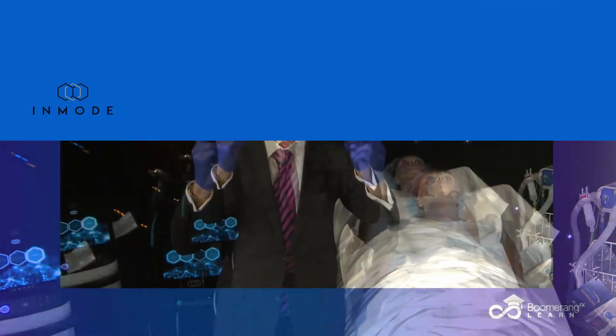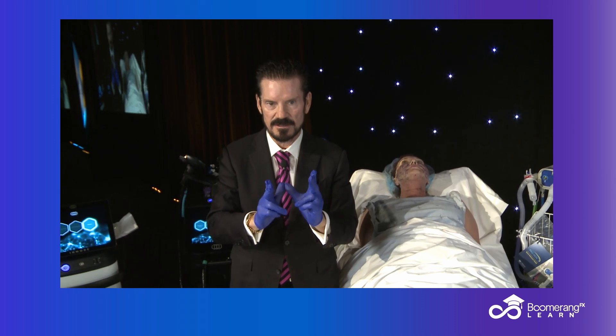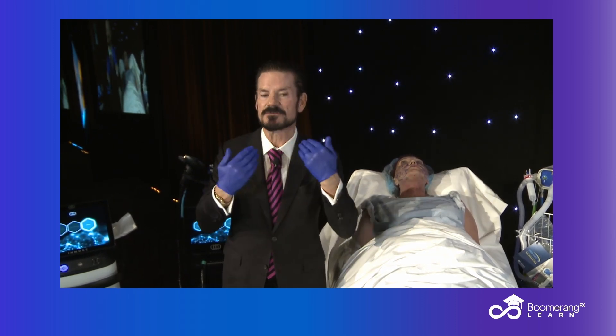We are doing part two of injectable RF face lifting and shaping. The first part, we treated her submentum and her neck.